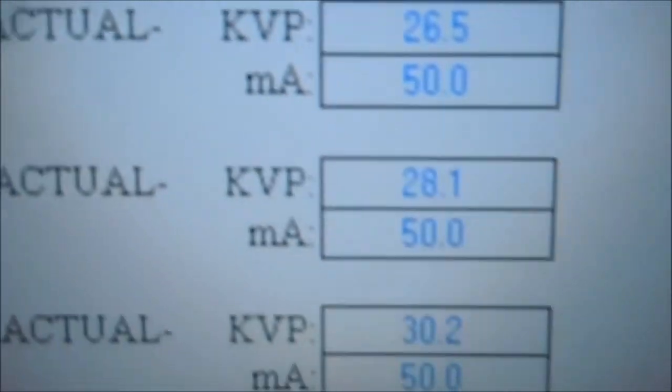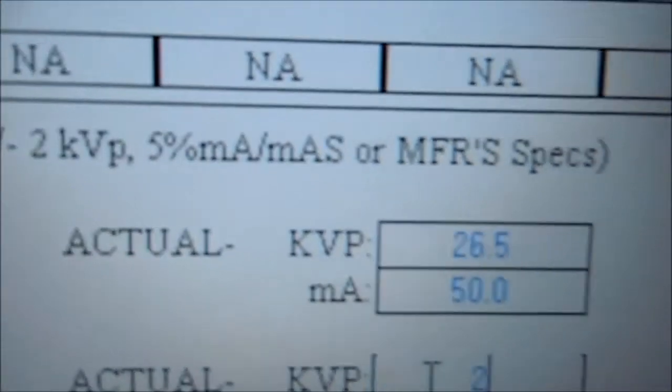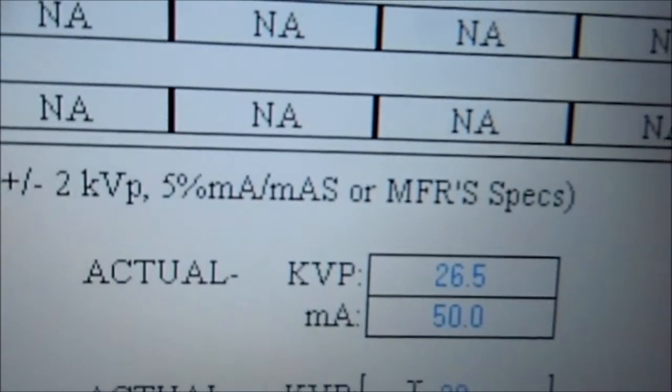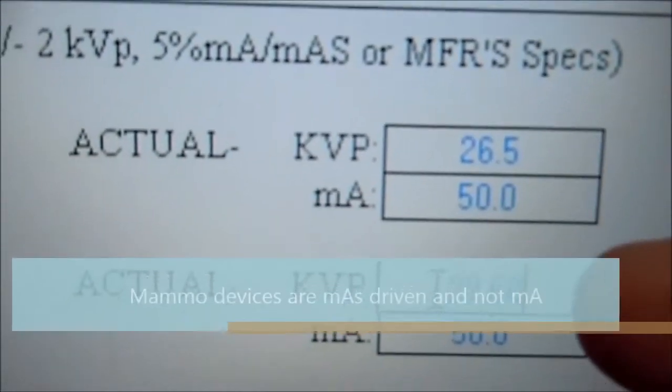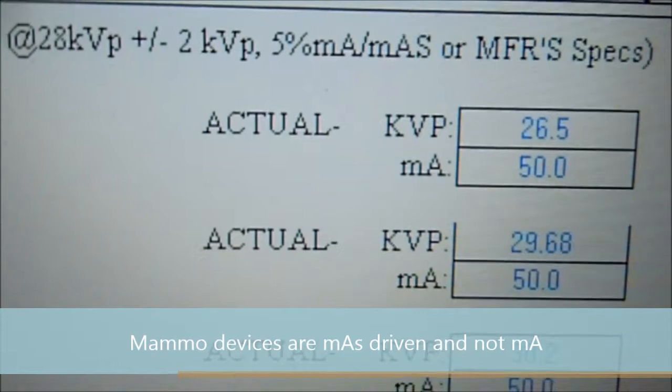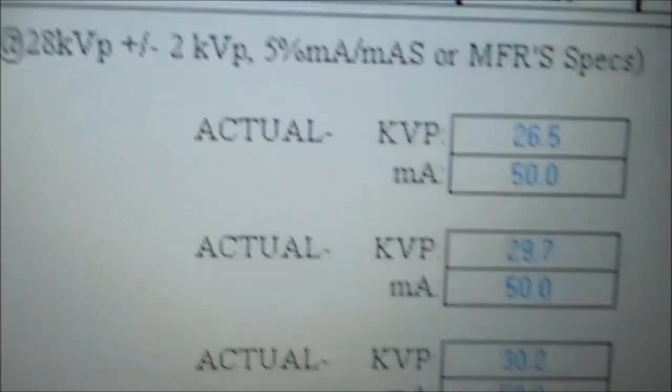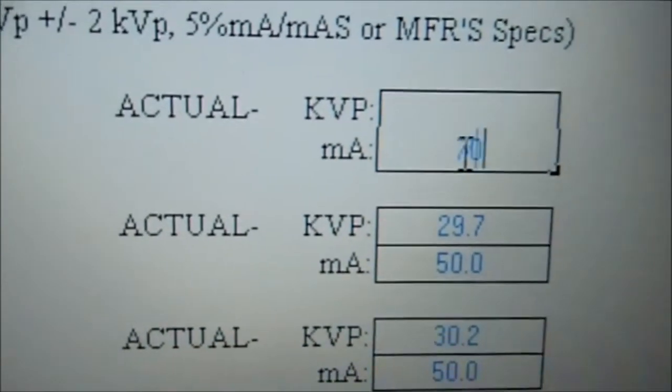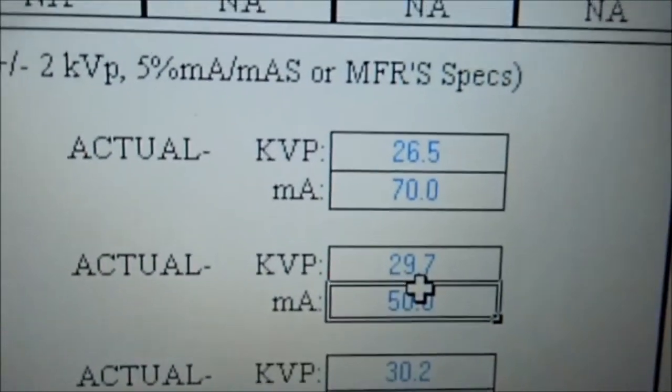Which we will log here. 28. We'll put here 29.68. And we can adjust the MA to 70, which is what we're actually taking it at.